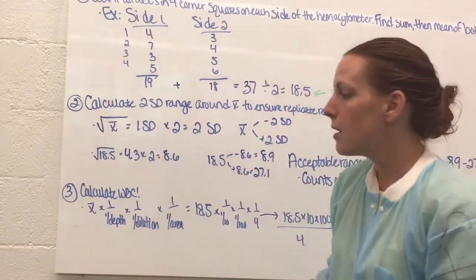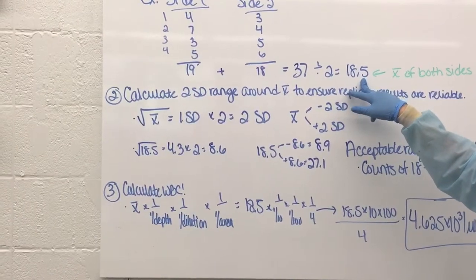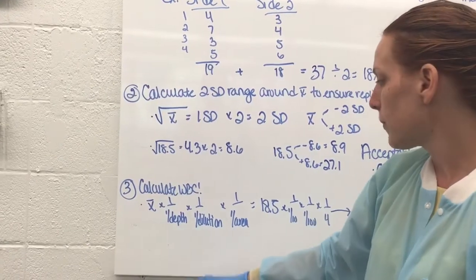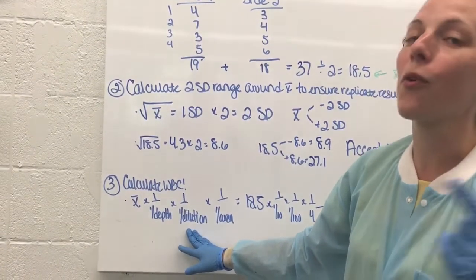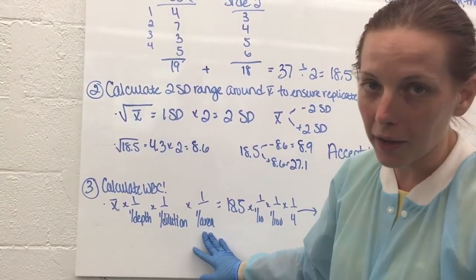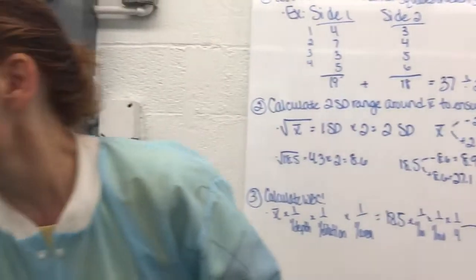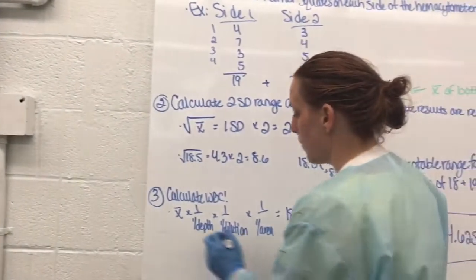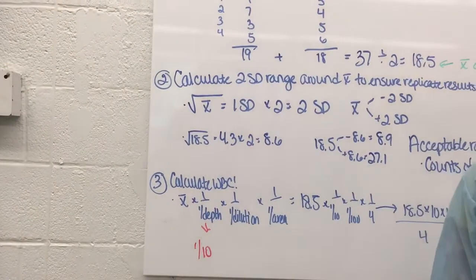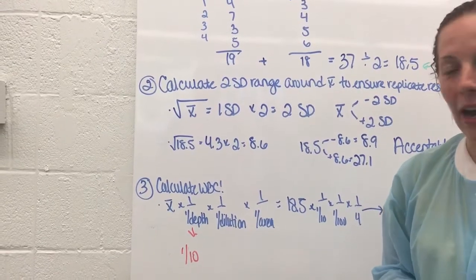To calculate your WBC, you again need the mean of both sides, and we're going to multiply that by 1 over the depth of the hemocytometer chamber times 1 over the dilution that we used, and then 1 over the area that we counted. Now, we're lucky because one thing in this equation is always going to be the same. The depth here is always going to be 1 over 10. Always. That will never ever change no matter what kind of a count we're doing.